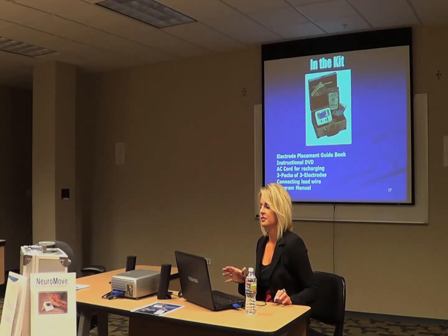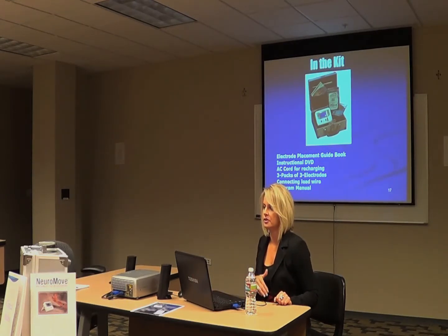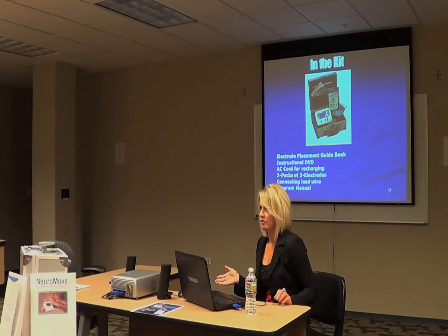That device needs to probably be recharged, say on a Friday when all your therapists are leaving for the weekend. Go ahead and plug it in and recharge it, and then it'll be ready on a Monday morning for your therapies again, once a week. It can't be used plugged into the wall, so it needs to be charged and unplugged.